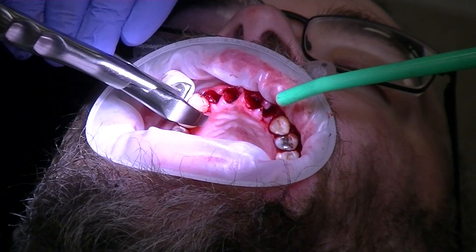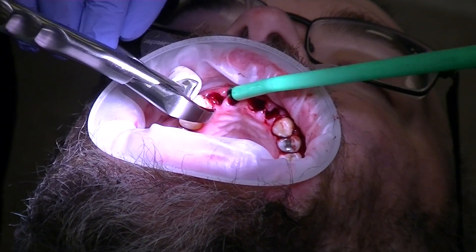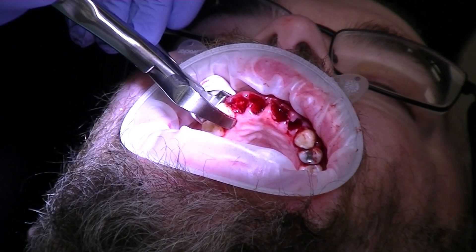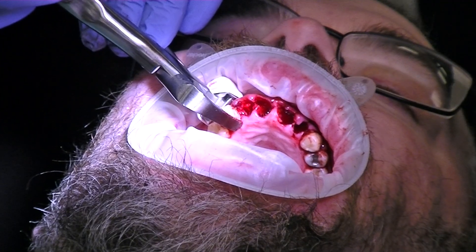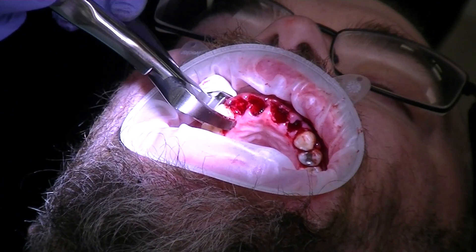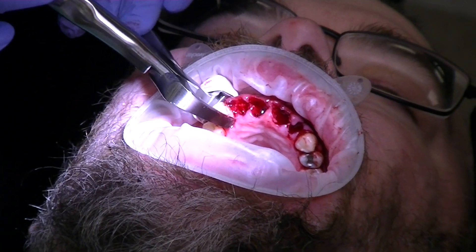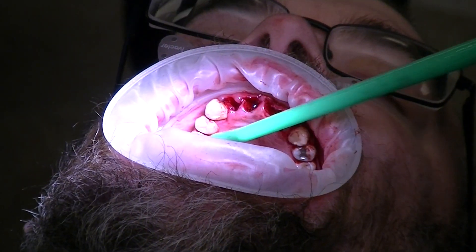The canine angles distally, so I don't want to be on the wrong long axis. Make sure I follow the correct long axis — go right here and do the same thing. Give it a little twist and just hold it there. See how I'm using two hands? Don't squeeze hard — everybody wants to squeeze hard and you're going to break it. Go another five degrees. Everybody see the movement? I let go and go to the regular forcep.